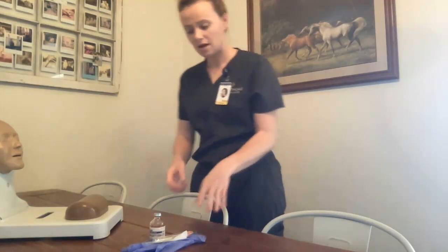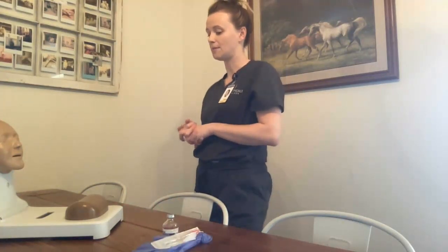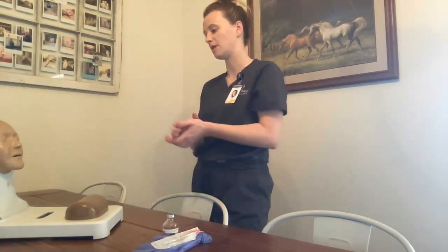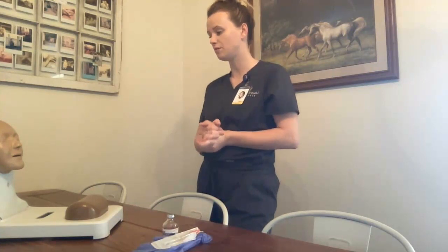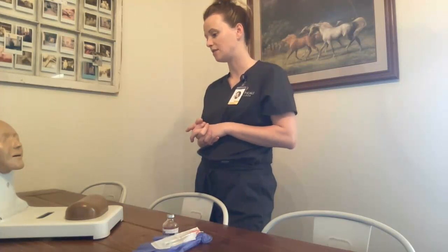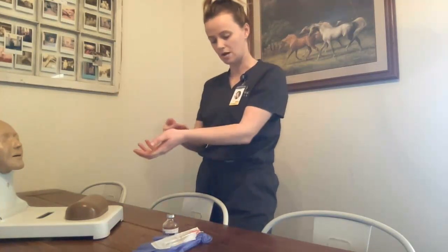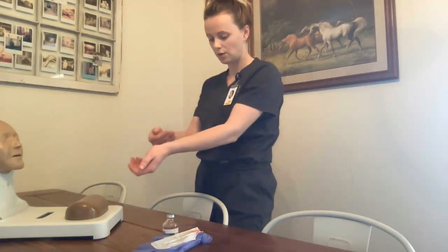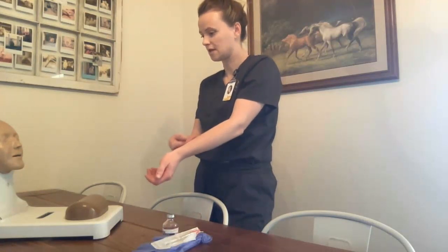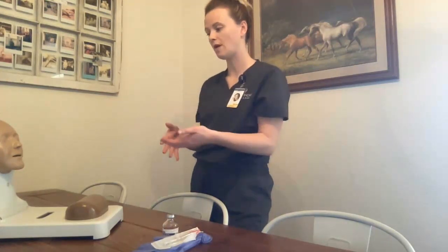Alright, Mrs. Smith, as you can see here, I have some supplies for an injection. Your physician ordered you to have a PPD test done. That's commonly known as the PPD, but the name of the medication is tuberculin purified protein derivative. The mechanism of action is that it causes a delayed hypersensitivity lymphocyte reaction. The use of the medication is that it's a skin test — we would inject medication just under that top layer of skin here on your forearm to diagnose whether you've been exposed to tuberculosis or if you have it.